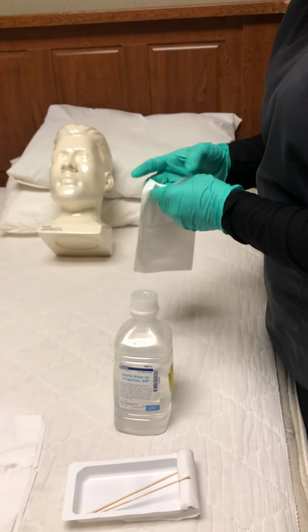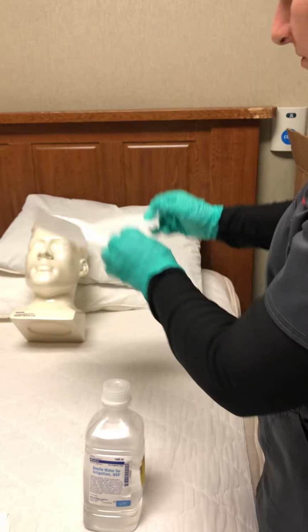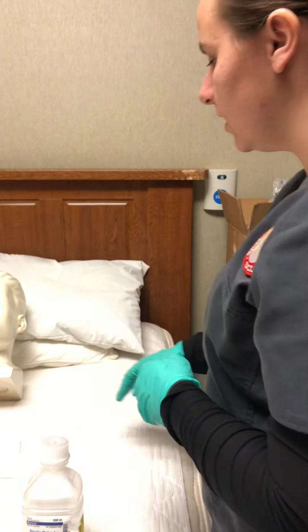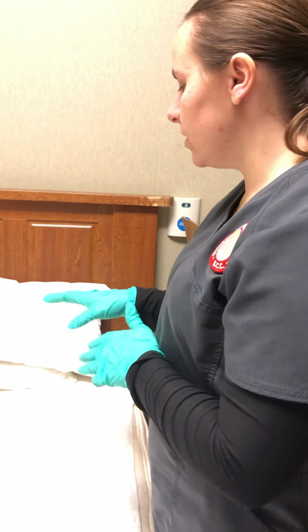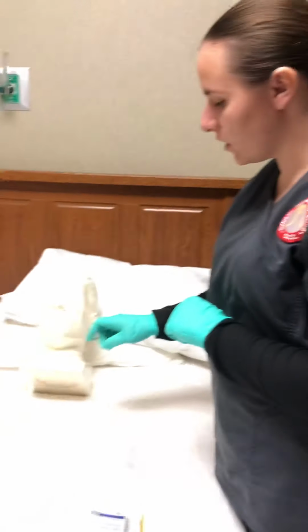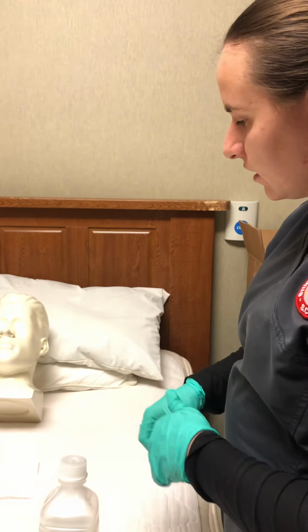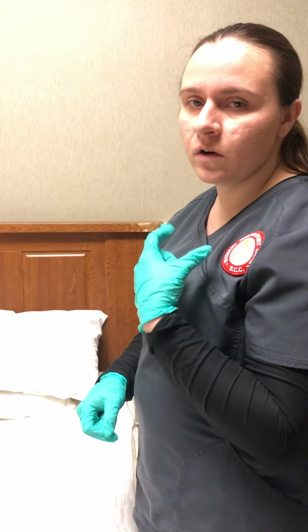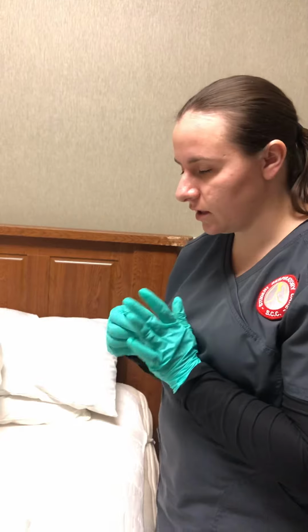Then I'd have a sterile drape just to go over, just in case they have any secretions. That way it doesn't get on them when I'm cleaning or anything like that. And so when I'm ready, then I would always check the trach before I remove it or anything, and see what it looks like, see if I need to remove the inner cannula, if it's a disposable one, or if it's going to be one that I have to take out, clean, and place back in.